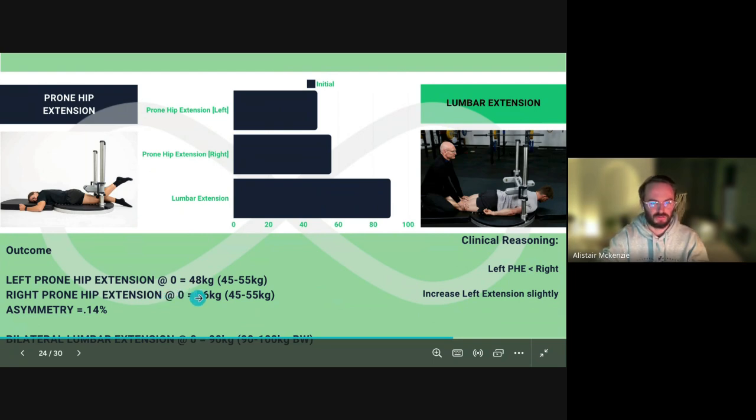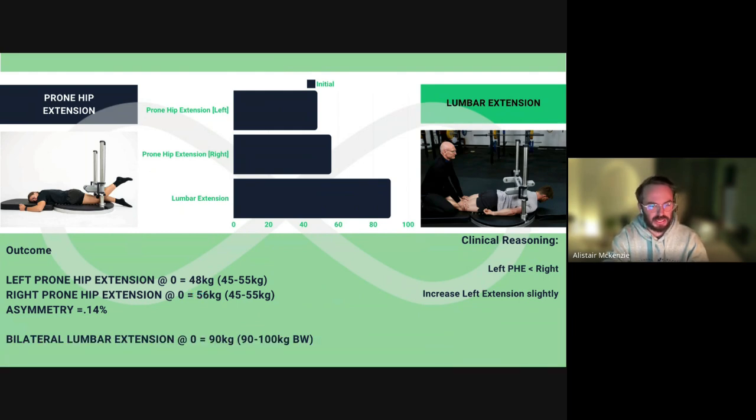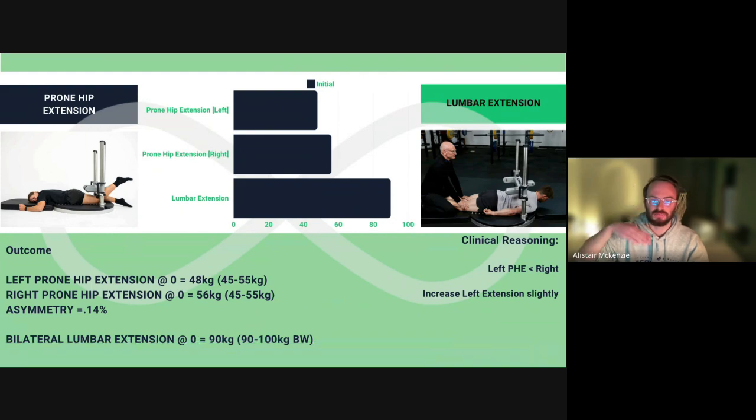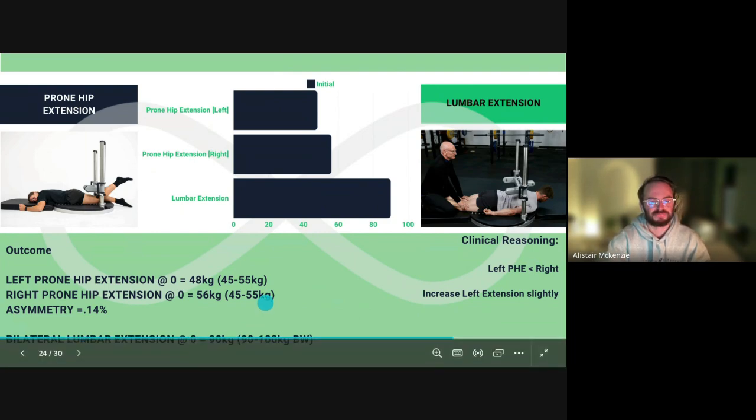So an interesting food for thought of where we go with the clinical reasoning on this. We test it and we train it, and we utilize the KangaTech training to train specific areas and specific exposures, using impulse loads, using a bit of chaos on the force trace, trying to get them to bounce the force trace curve, coast, or trying to hold it. And we utilize that throughout, as well as then using it to feed into our other exercises where we try and manipulate the same adaptation.